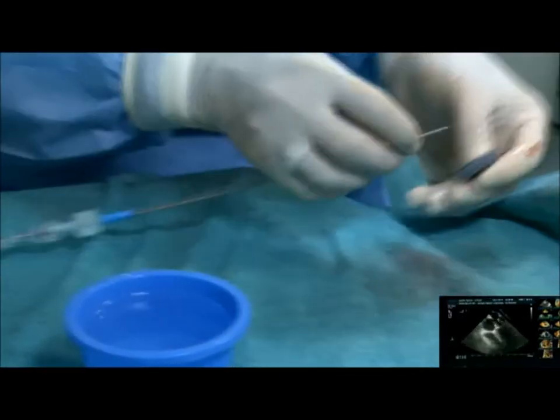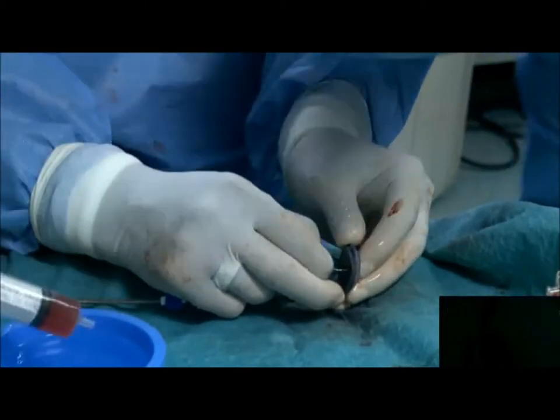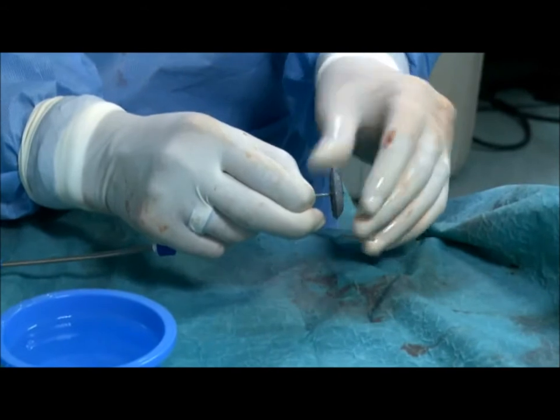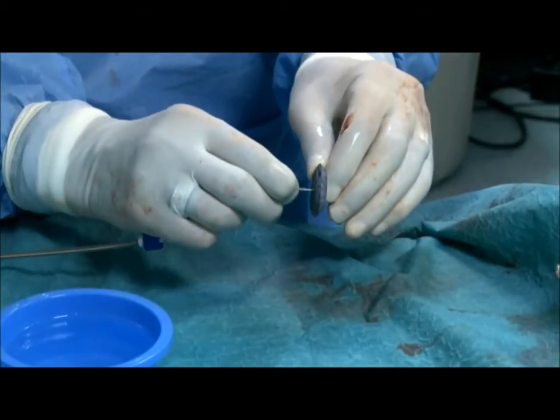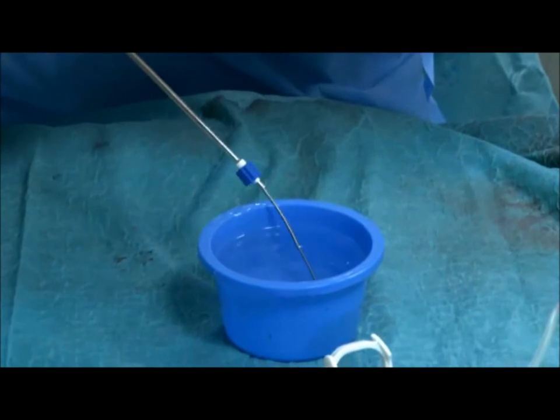Right, so this is a good test of the eyesight. So we attach the device really tight and then a little unclicking so that the device is not too tight. And then we load the device.